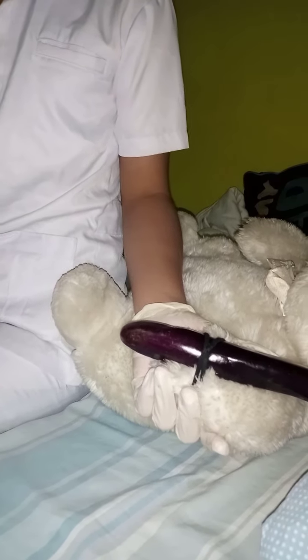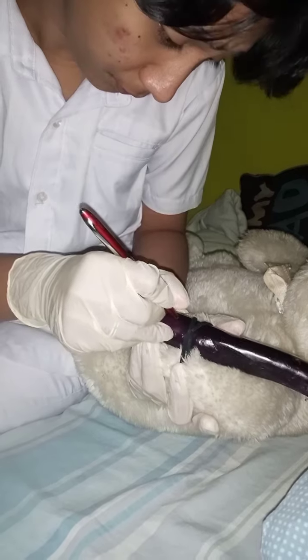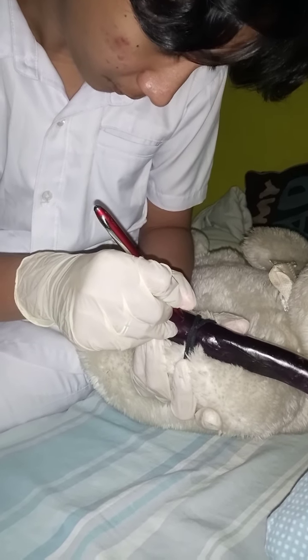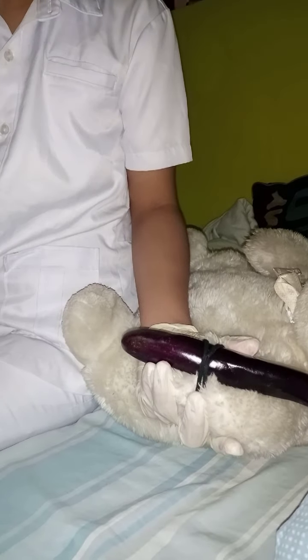So now, encircle the injection site with ink to observe for redness or induration, hardening, per agency policy. So we're using the black pen. Why don't I use the red pen?